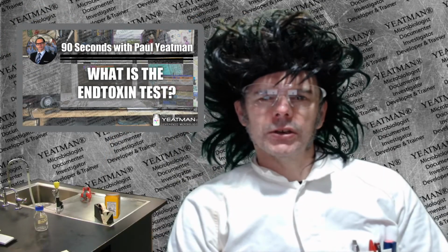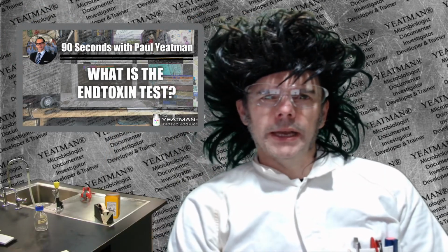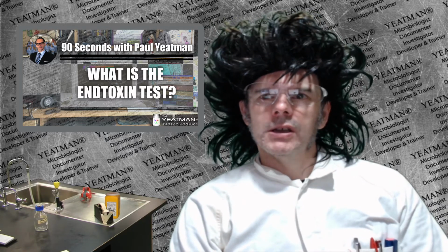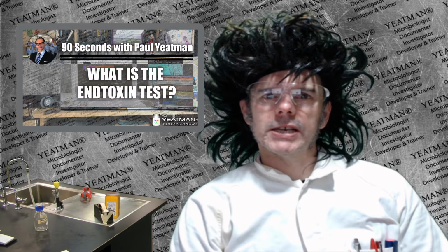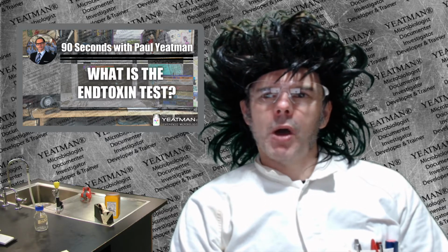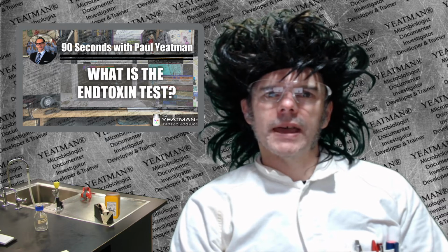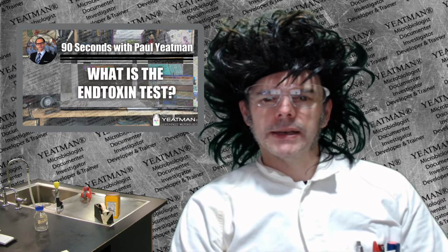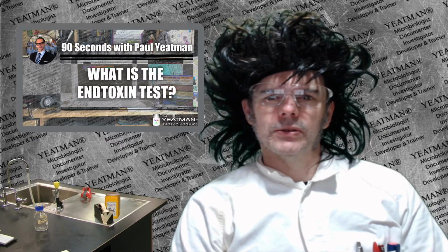What is the endotoxin test? An endotoxin test looks for the leftover bits of dead microorganisms. One would typically test injectable sterile products for endotoxins. Endotoxins are known as pyrogens and are substances that, if injected into a person, could cause fever and, in a really bad case, death, and that's not something you generally want.